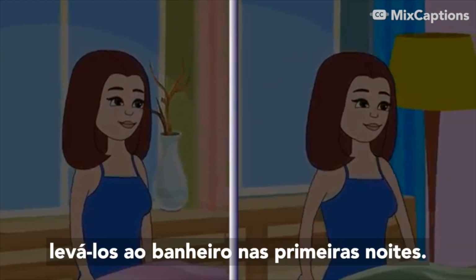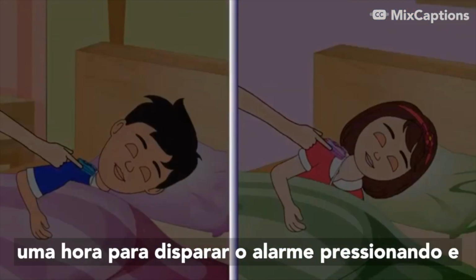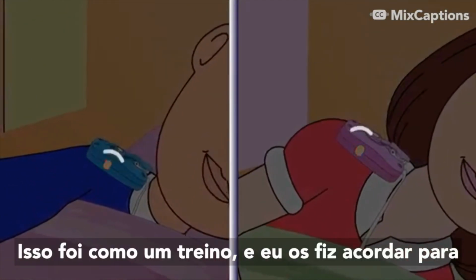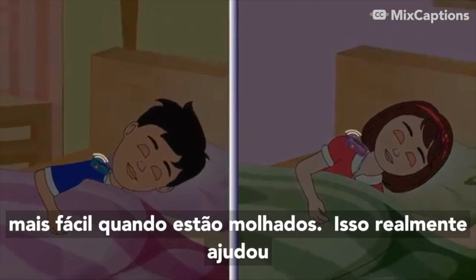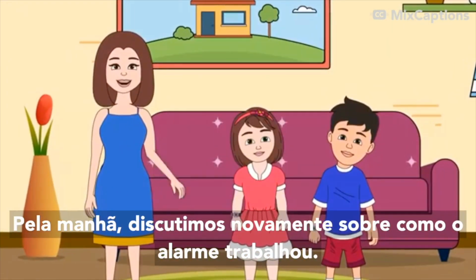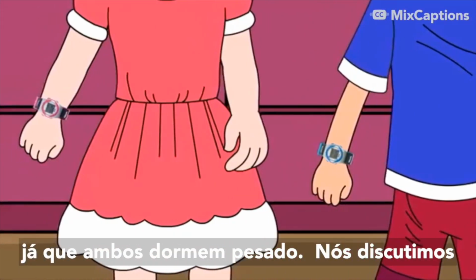For the first few nights, I waited until the kids were asleep for about an hour to trigger the alarm by pressing and holding the white button for 5 seconds. This was like a drill and I had them wake up to use the restroom. This prepared them to wake up easier when they are wet. This really helped train their bodies to respond to the alarm. In the morning, we discussed how the alarm worked again, and I promised to help them wake to the alarm since they are both heavy sleepers.